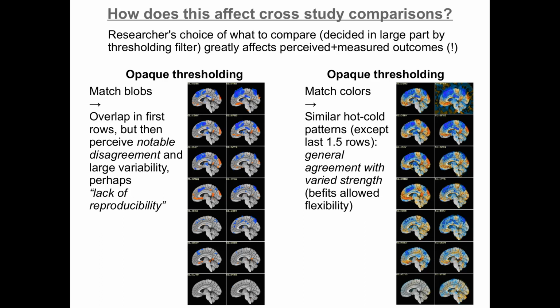Researchers could also choose whether to use the magnitude of the gambling values that were assigned to weight their results or not, or to orthogonalize rather than using amplitude modulation. And whatever threshold could be used, what kind of quality control to do, whether to exclude subjects or not, all of these things which are realistic to the amount of variable choices in the field, but there was actually a fair amount of variability left up to the researchers. And so this amount of varied agreement of strength of results seems reasonable to me. So there really is a choice.